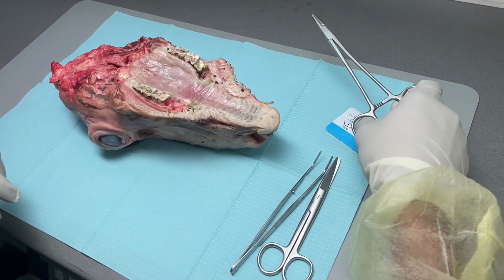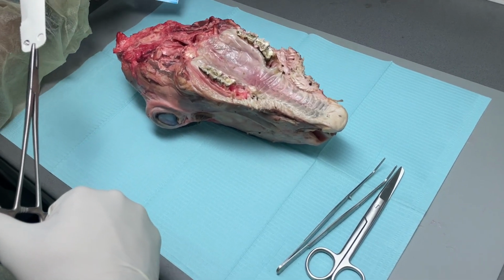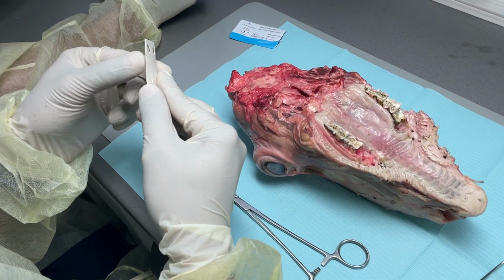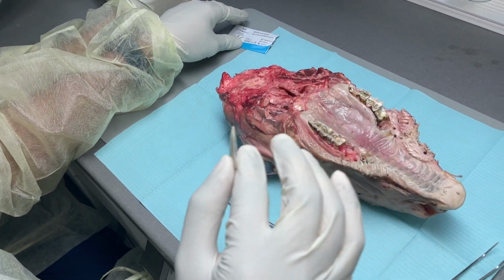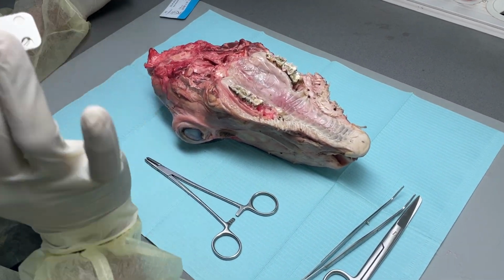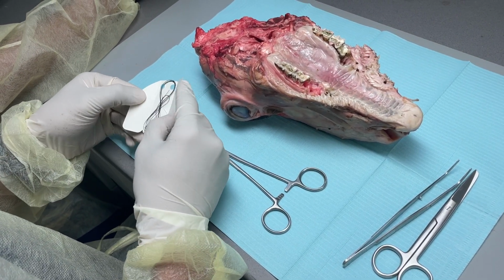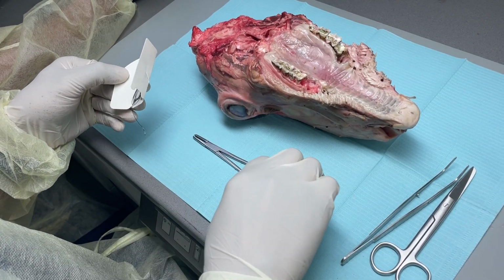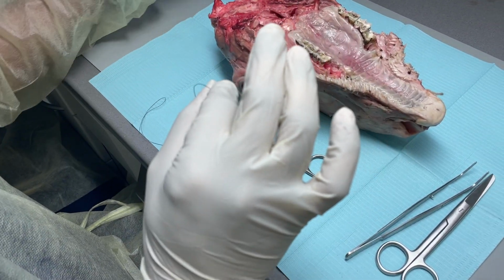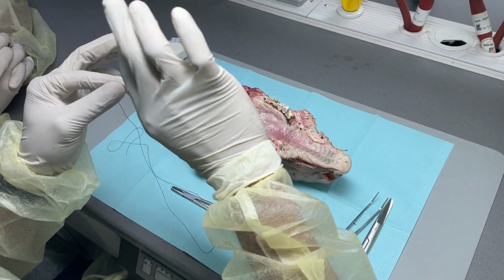Now let us see. Now we will take this and pull it out. There will be packaging like this. Maybe your assistant can touch the external part, but they should not touch the internal. That is for you to do. Then you will unpack it. Ideally you should not poke your hands in, just take it out. This is your suture material.